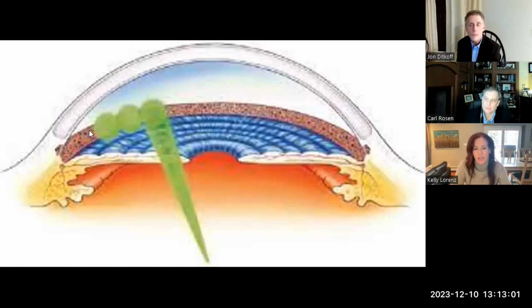So I tend to use this laser either at the outset with very mild glaucoma, or simply somebody that has high eye pressures, something we call ocular hypertension. But I'll also reserve it for very refractory cases where they've been through pretty much everything else that I've had to offer, and the laser sometimes helps as a temporizing measure to additionally lower the pressure a little bit.